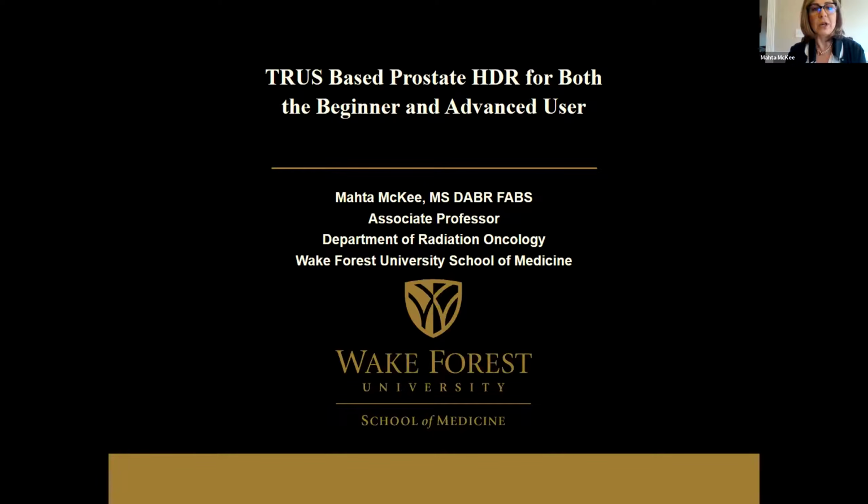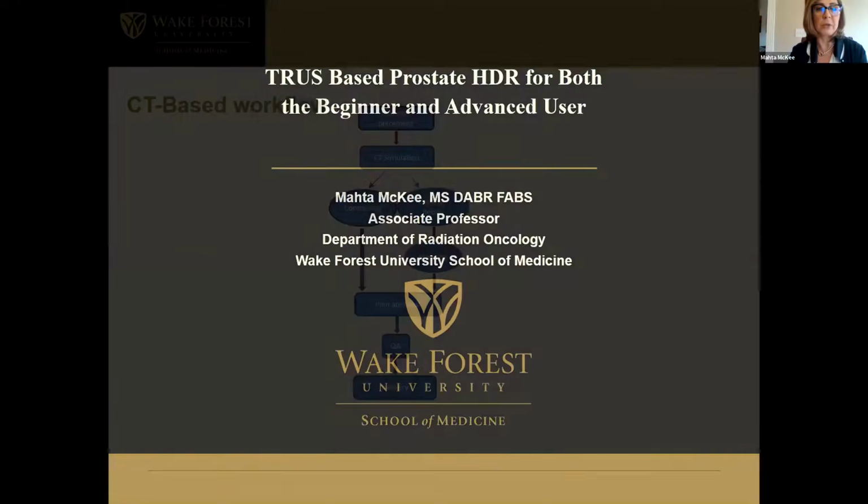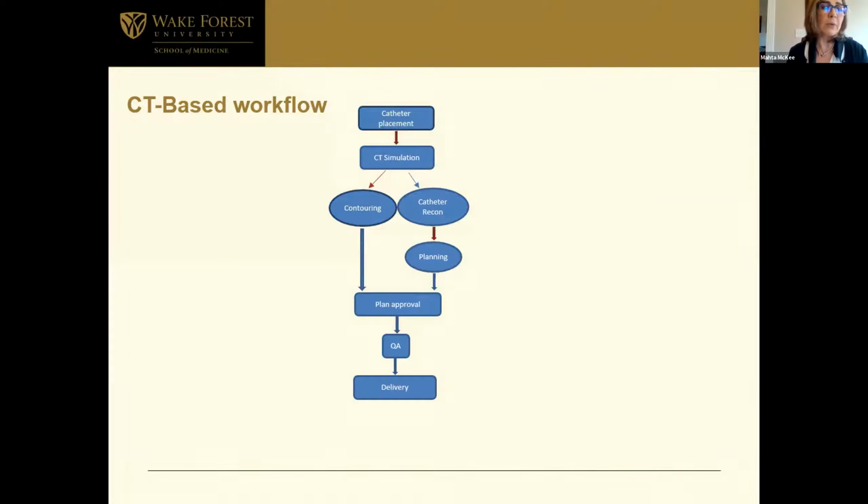What I'm going to concentrate on is mainly going to be physics related and the ABCs of what you need to look for when you're doing ultrasound-based prostate brachytherapy. Before we start with the ultrasound, let's have a workflow comparison of what a CT-based prostate workflow is versus an ultrasound base. So in a CT base, you've got the catheter placement. Now that could be done in the main OR or if you have a brachy suite. Depending on where you are going to be putting the catheter placements, the patient needs to stay in a PACU or a holding area before they could be moved to a CT simulation.